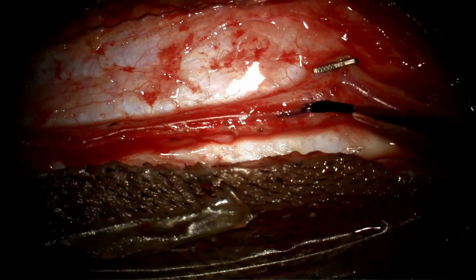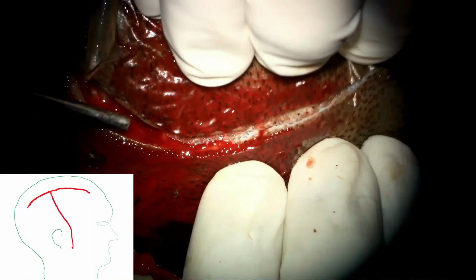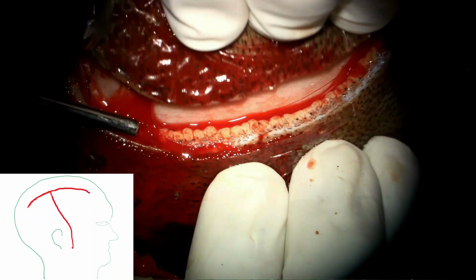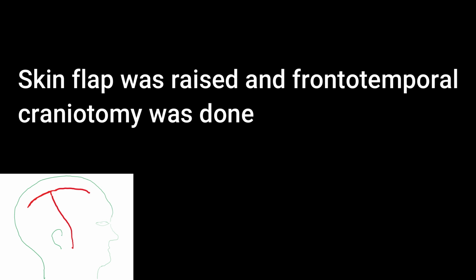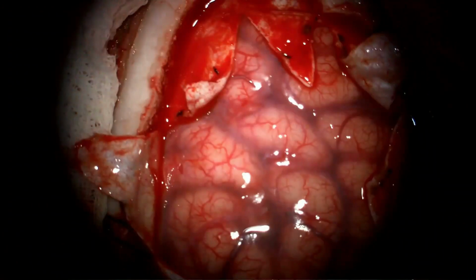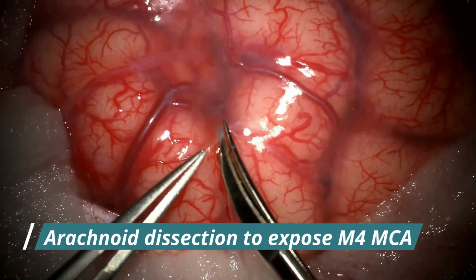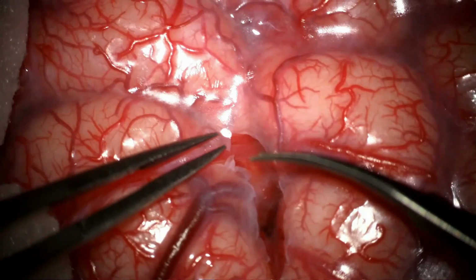The STA is being stained using methylene blue dye for identification purposes. The skin flap is extended towards the frontal and parietal regions as shown in the schematic diagram. A frontotemporal craniotomy was done. The dura is opened in cruciate fashion. Sharp arachnoid dissection is started in search of a good recipient M4 vessel.